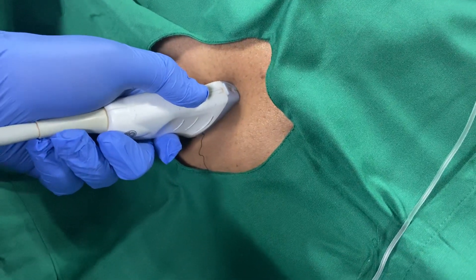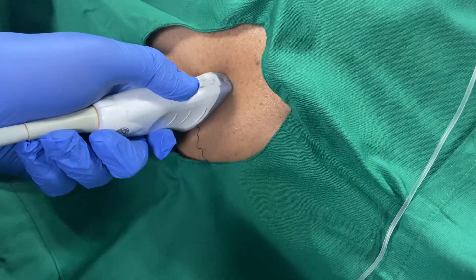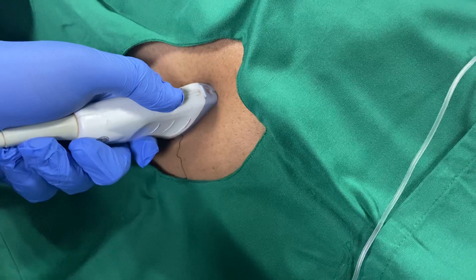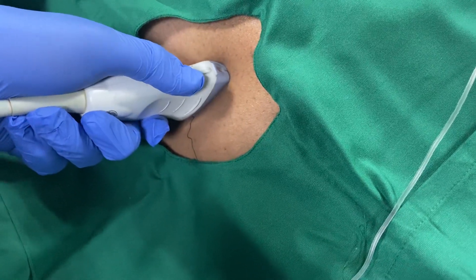Good morning friends. This is a patient for inguinal hernia repair by laparoscopic technique. For postoperative analgesia, we are giving ilio-inguinal and ilio-hypogastric nerve block with ultrasound.